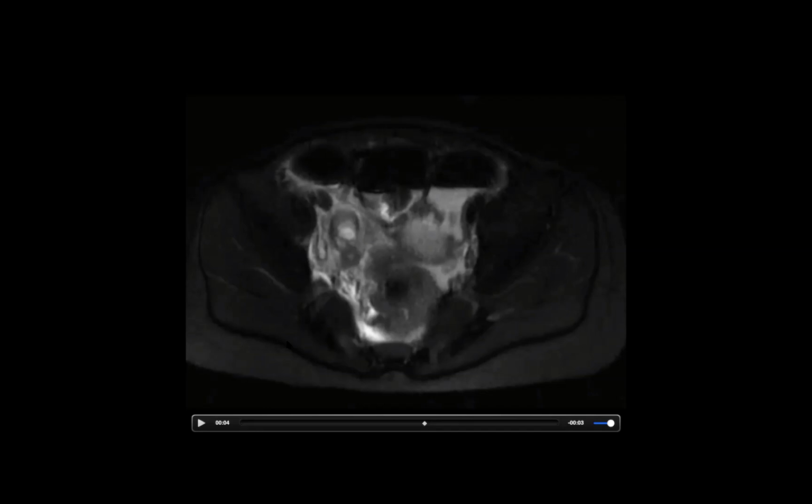Yeah, so if you have a gradient echo image, then you can get effects at the boundary of fat and water, these dark lines due to signal cancellation where there's fat and water in the same voxel. Okay. This is a spin echo image, so I'm not sure that the logic you applied is correct in this case. Yeah, it's a good thought, but I think there's more to the story on this one.